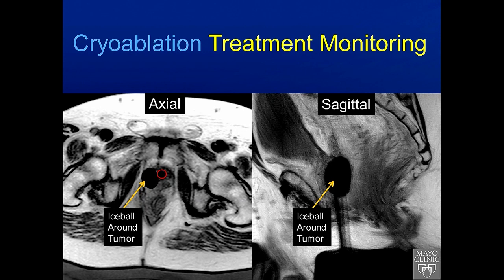The tumor can be targeted with MRI, and then during the cryoablation we monitor the growth of the ice ball, shown here in black. We can see its relationship to the urethra, where we have a urethral warmer, and the rectum posteriorly, which we have displaced with injection of saline between the prostate and the rectum.